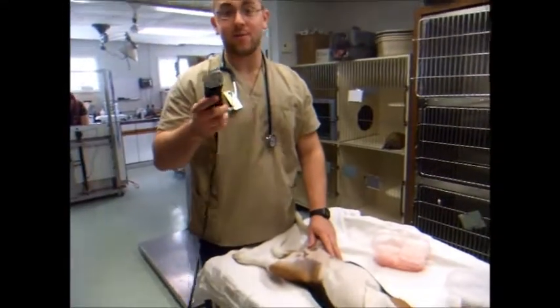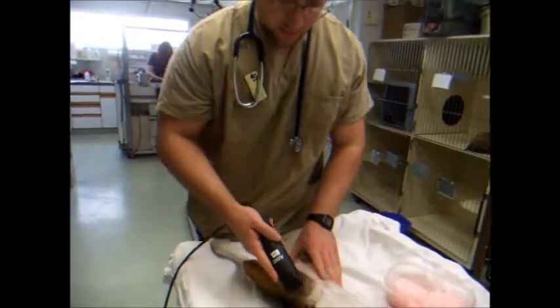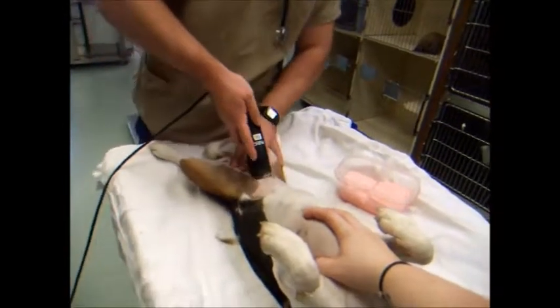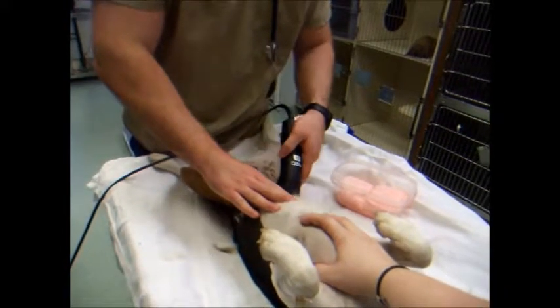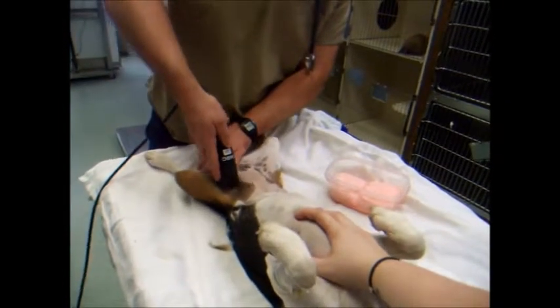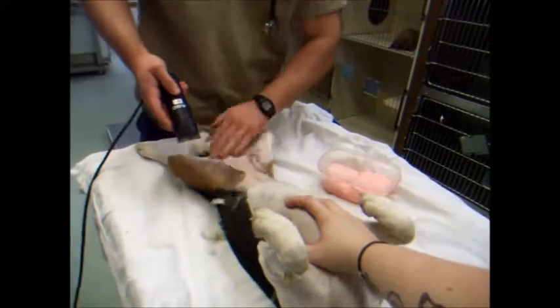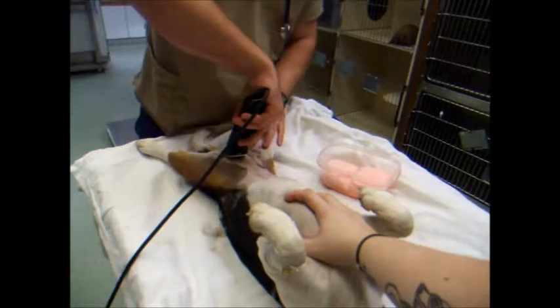I'm going to go ahead and prep this patient for surgery today. She's getting spayed. So I'm going to go ahead and shave her abdomen area here. And then we're going to use chlorhexidine and alcohol prep. And I'm going to make sure to go from the inside out in a circular motion, once I'm done shaving here.